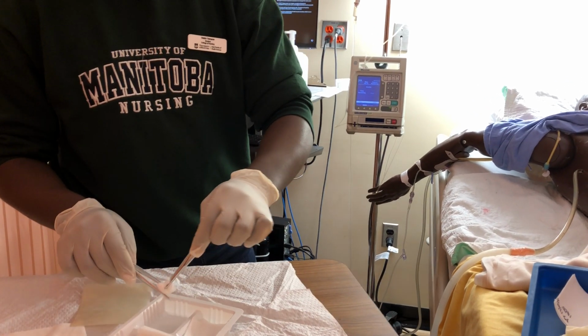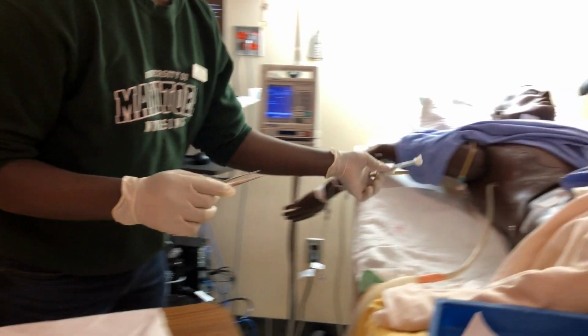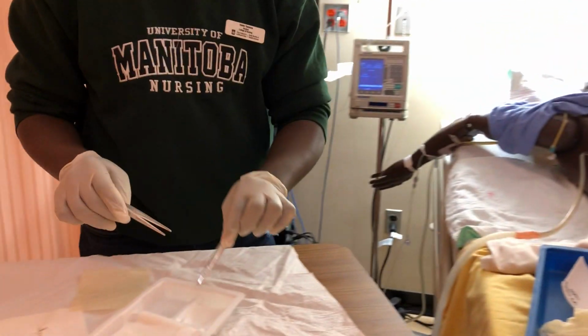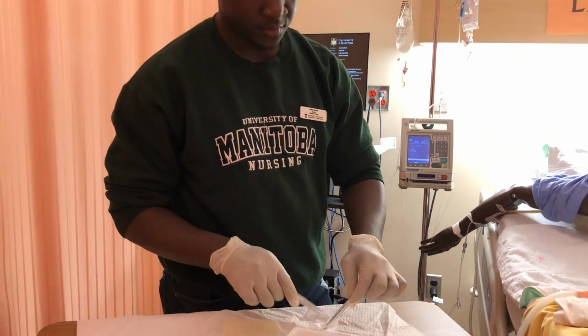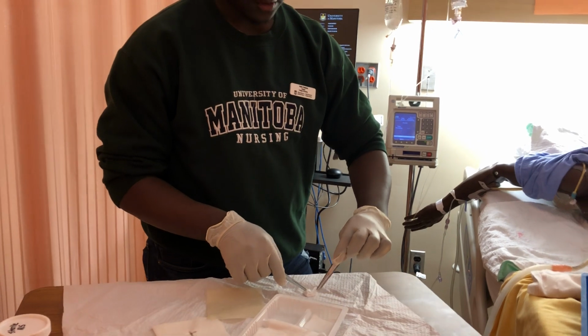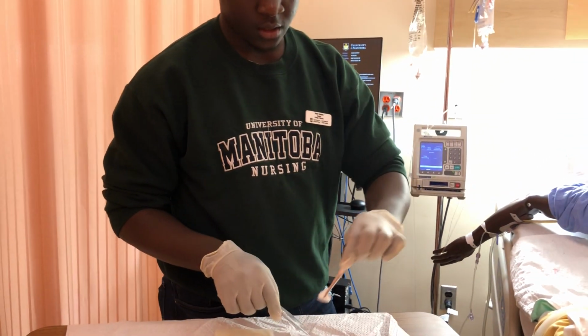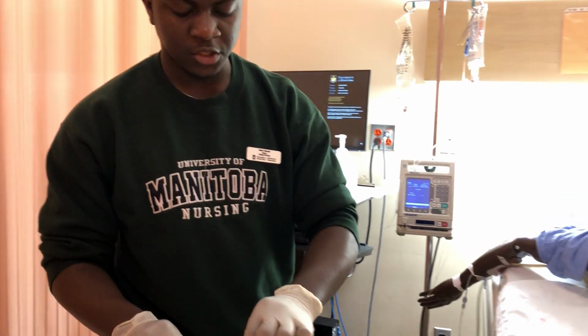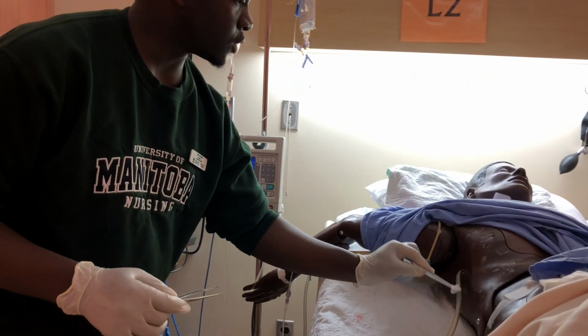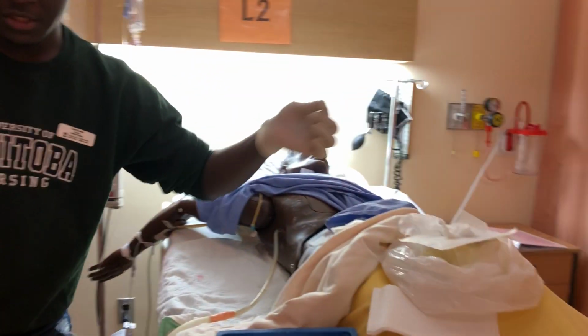So now I'm just going to open up my cannula into my field, and then click from the bottom outside. And I will just do one more time to clean the tube itself, because the tube will be covered with a dressing. So I want to make sure that I'm not covering any bacteria in there. Make sure everything is sterile before I put on my new dressing. Just clean this on the tube once, and I'll garbage it as well.